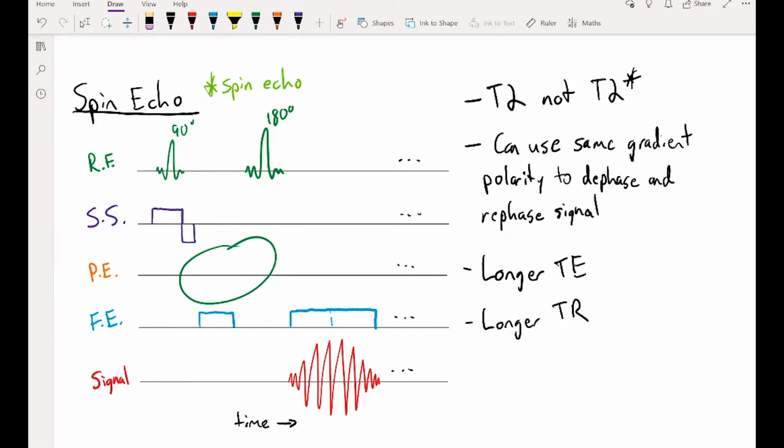So as we repeat this, we're going to be using different gradients. I'm just briefly drawing and disappearing to visualize what that might look like, to incur different phase differences and then record that signal again. This is very important for us to actually interpret where signal is coming from in a slice, though I haven't exactly talked about why yet. I think it makes more sense once we talk about k-space, which is next in our talk for today, probably what we're going to end on.